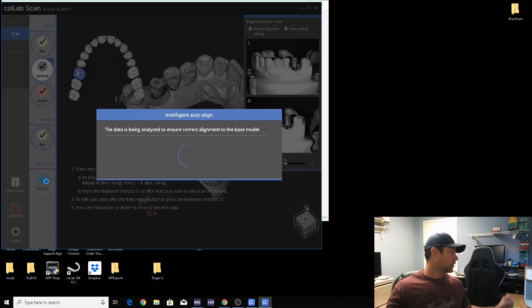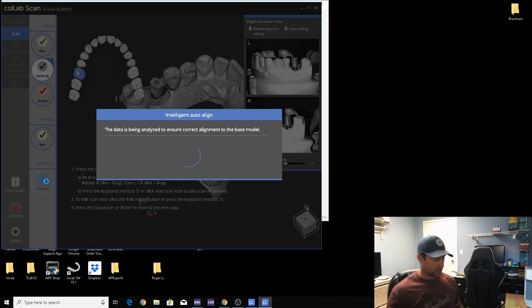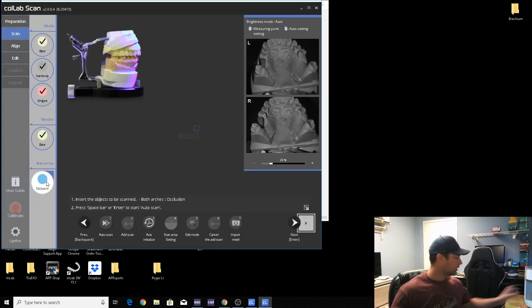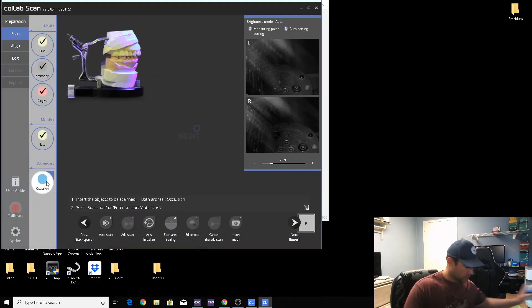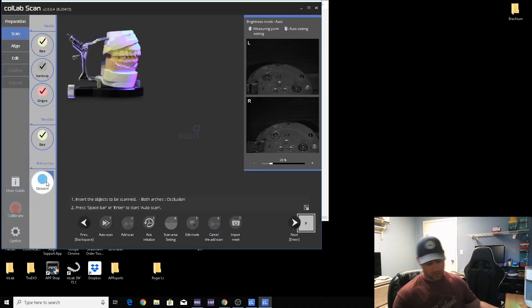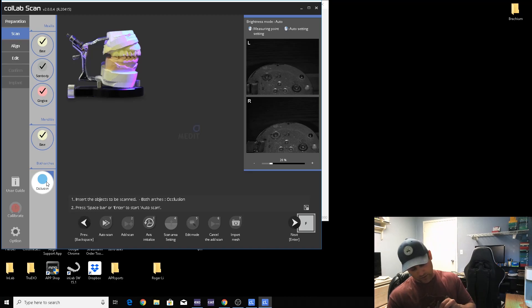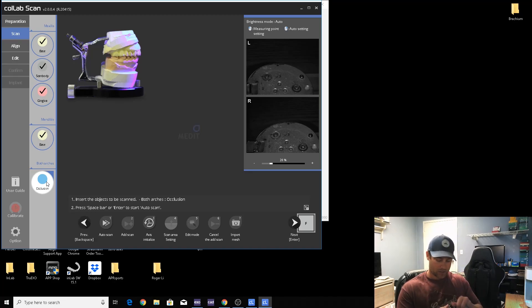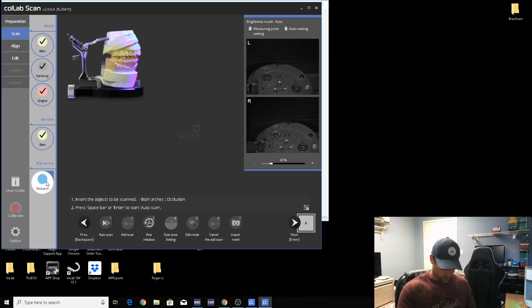This hole doesn't matter. It's this flat surface right here and over here. We've got plenty of data here to go ahead and orient it. So now we can just go ahead and scan the bite. Let's take the scan body out because often times when you try to scan with the scan body in there, the bite won't close down all the way, so let's go ahead and take it out.